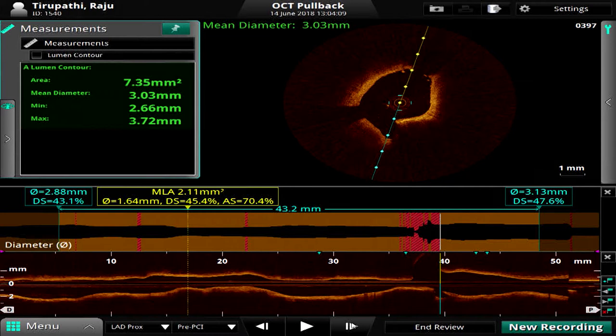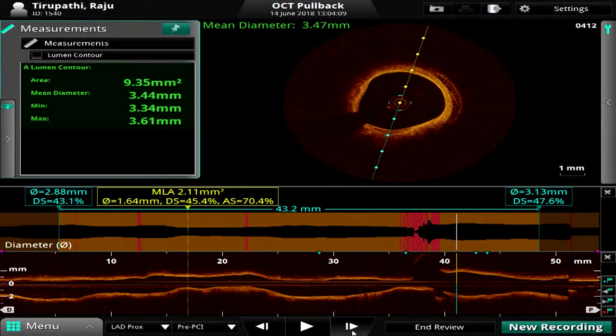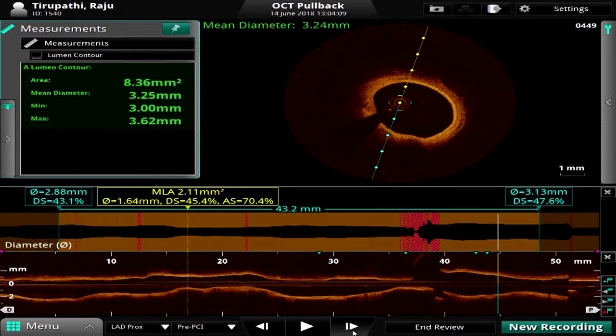And if you go back, just forward, please. And angiographically, left main had a bit of plaque disease, and that's compatible with the OCT pictures. Apart from that, the left main looks reasonably okay, with a bit of calcification, but no significant stenosis in left main. Back to Dr. Ravi. Thank you, Dr. Shiv.